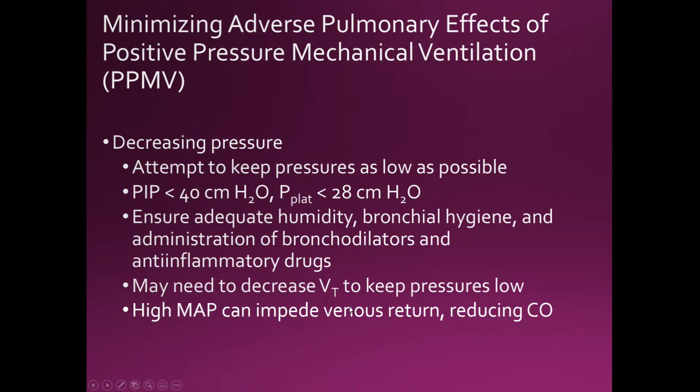You might also have to decrease the tidal volume to keep the pressures low. Again, with pressure, yes, you want to control the pressure, but you want to make sure that tidal volume is also falling under the minute ventilation.